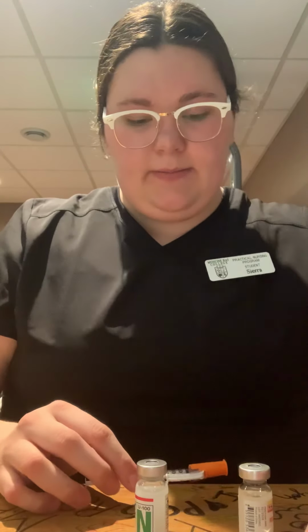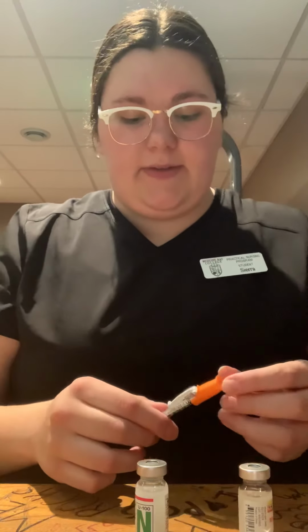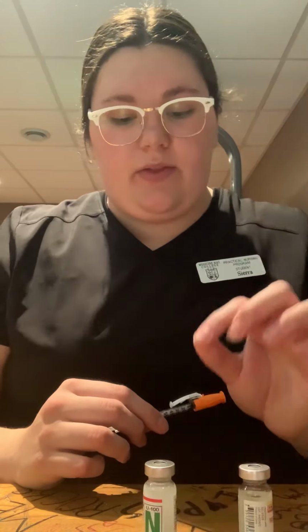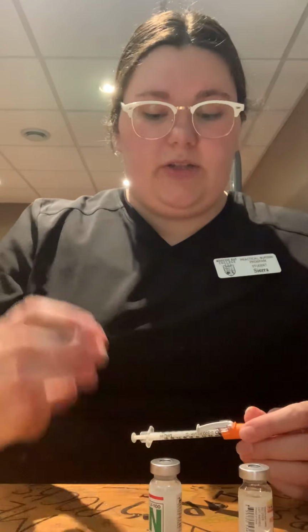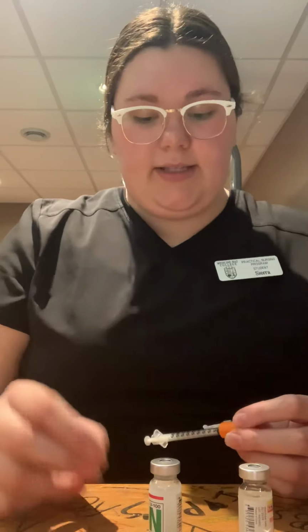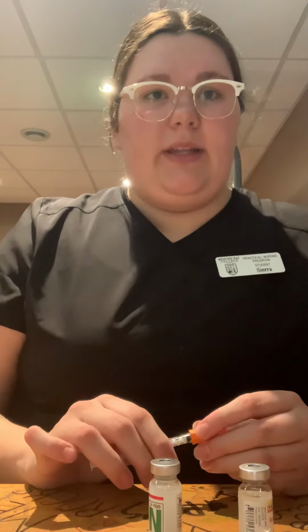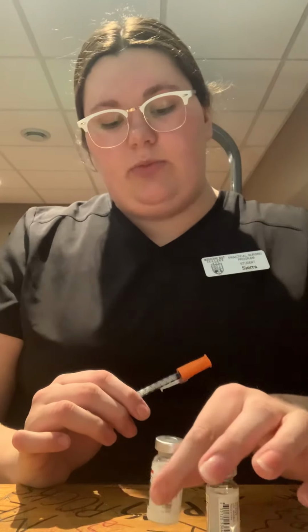We will take our needle out of the package and get that ready to go. What we're going to want to do is, because we need to put air into the insulin vials so that the liquid doesn't stay in there and it's easier for the insulin to come out, we need to administer the amount of air into the vials that we will be taking out. So for this one, we need 10 units of Humulin R and 10 units of Humulin N.